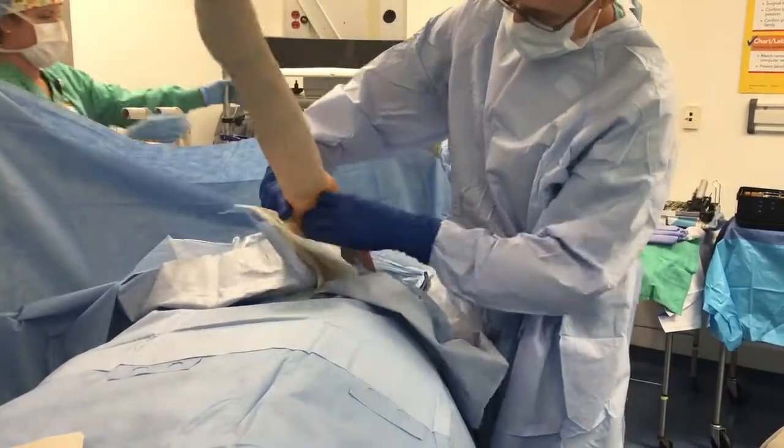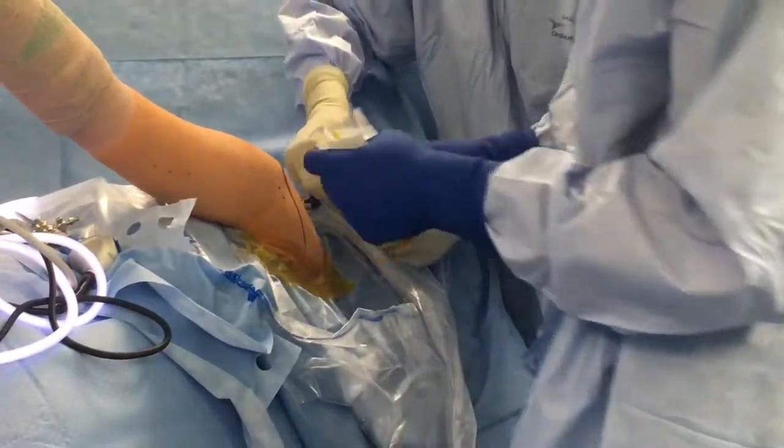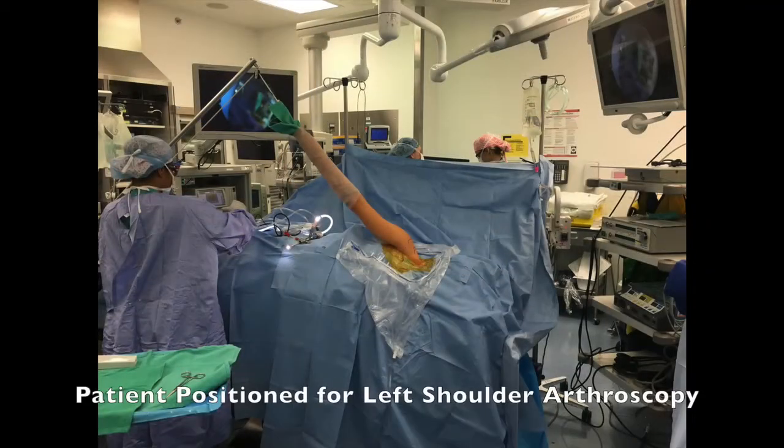The surgeon will then place Ioban made by 3M Healthcare around the edges of the operative area. The surgical team will then change gloves and conduct a final pre-incision timeout.